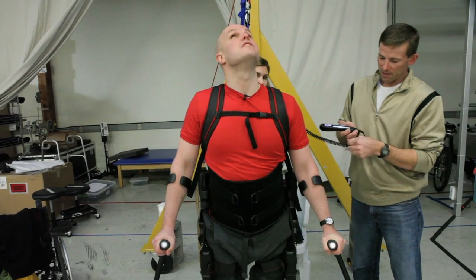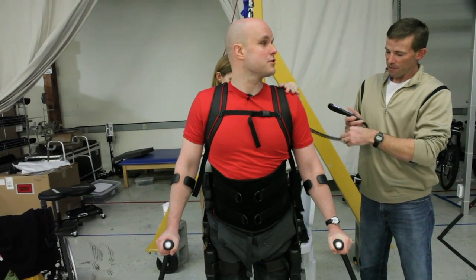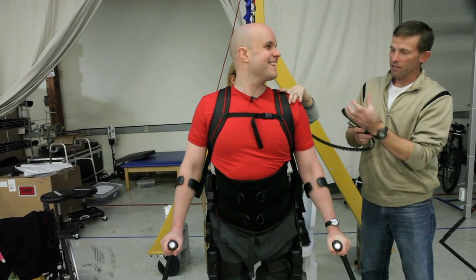And if I do fall, is this pulley just — is it tensioned enough? We haven't tested it in a few months. It'll be fine.